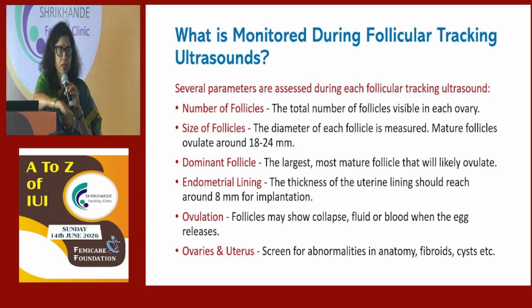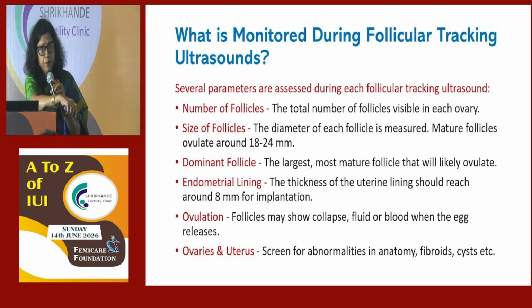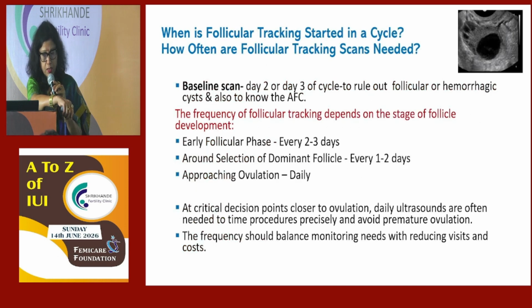Gradually you are monitoring the development of that follicle up to the dominant follicle. Simultaneously the endometrial lining, you are documenting ovulation, and of course you are looking for any coexisting pathology in the uterus and ovaries. So first and foremost you should start the baseline scan, that is day 2 or day 3, by yourself. Then how frequently you should call this patient? Don't call them too frequently.